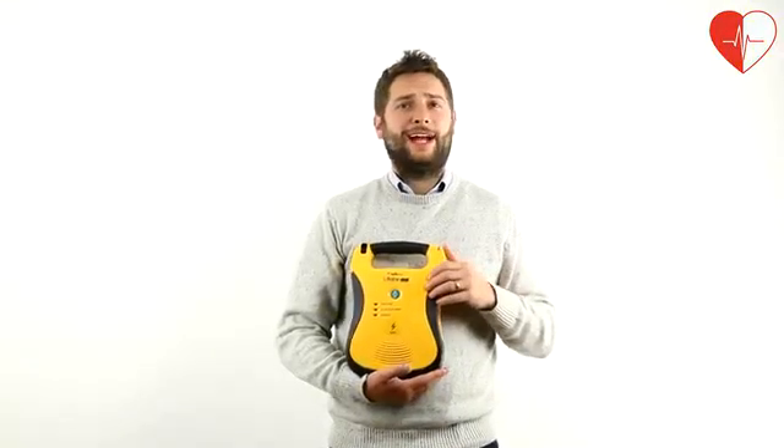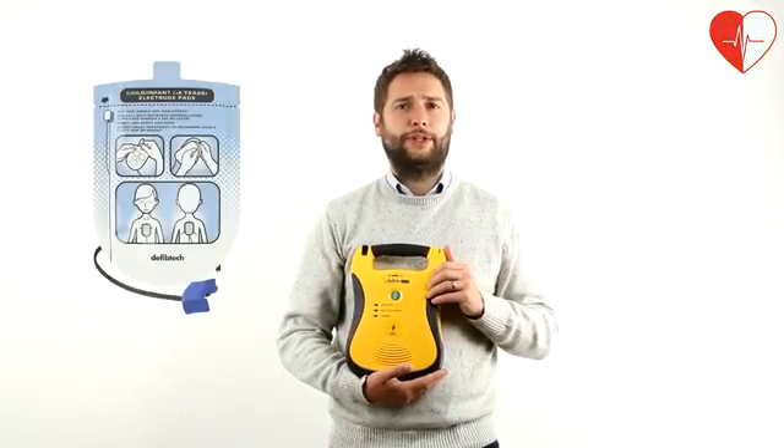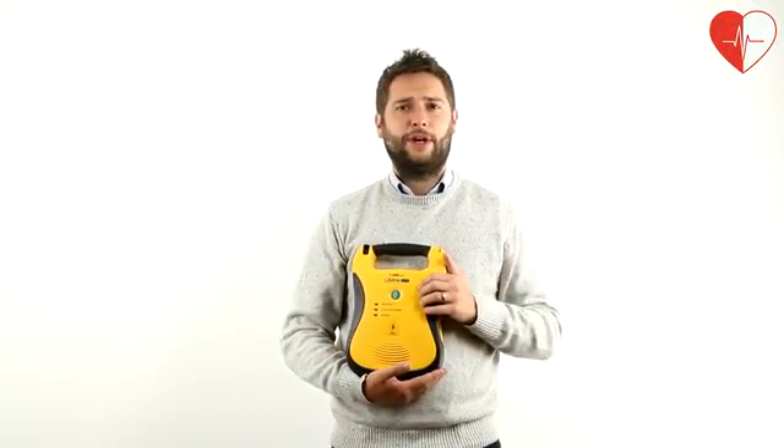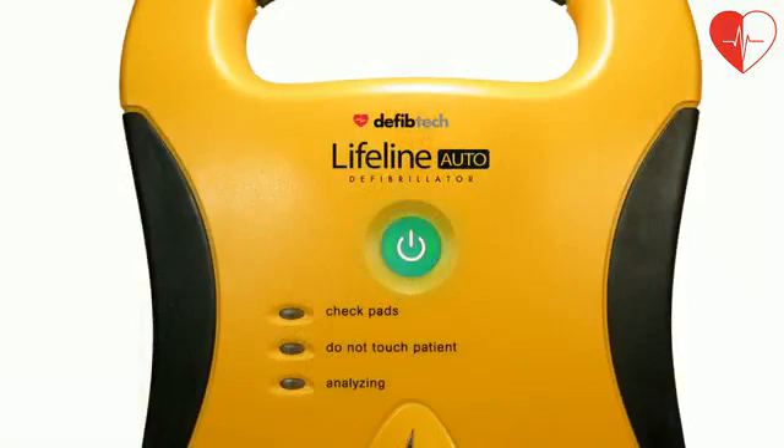The adult electro pads have a 2 year life as standard and paediatric pads are available as an additional option. The DefibTech Lifeline Auto AED is easily activated by pressing the green power button at the front of the unit.